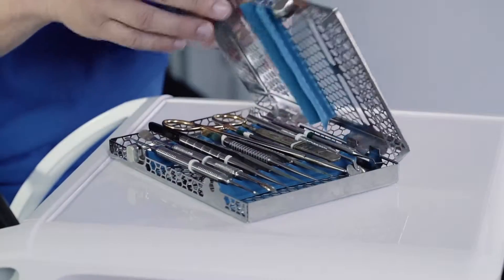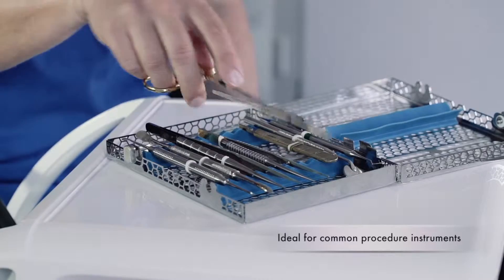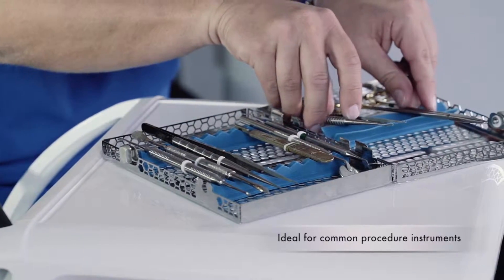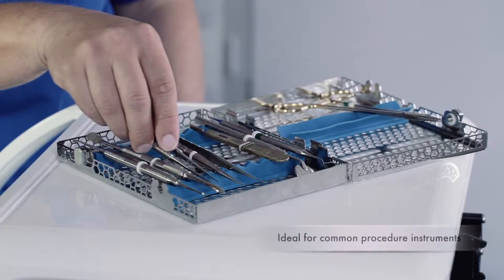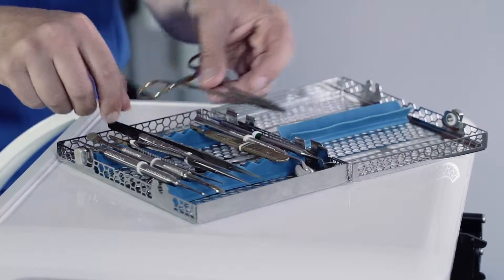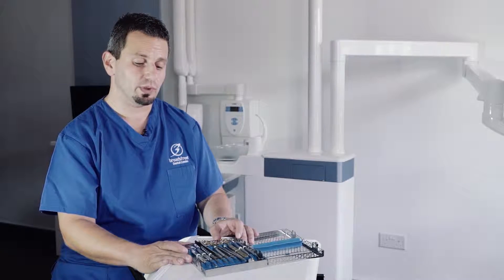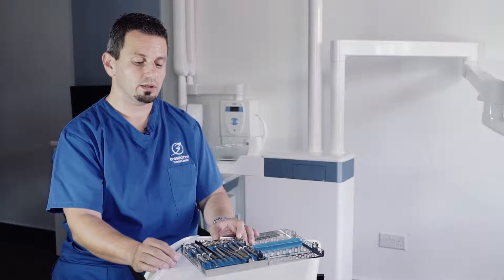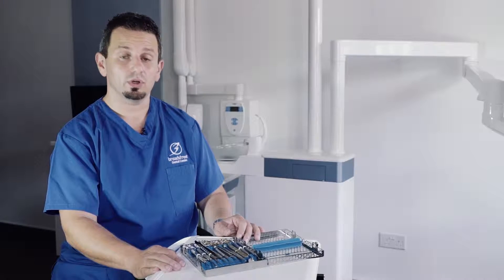It is the right size for packing instruments which you would need for minor procedures — opening a flap, uncovering an implant, doing some sutures after an extraction. You can use it for anything, but my personal preference would be a couple of pairs of elevators, tweezers, blade, and suturing forceps. And you're done.